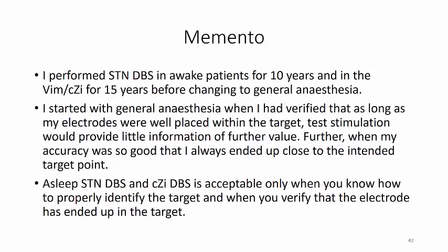I performed STN DBS in awake patients for 10 years and in the VIM zona incerta for 15 years before changing to general anesthesia. I started with general anesthesia when I had verified that as long as my electrodes were well placed within the target, test stimulation would provide little information of further value. Further, my accuracy was so good that I always ended up close to the intended target point. Asleep STN DBS and zona incerta DBS is acceptable only when you know how to properly identify the target and when you verify that the electrode has ended up in the target.